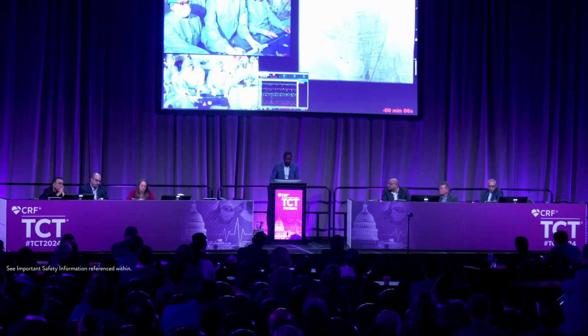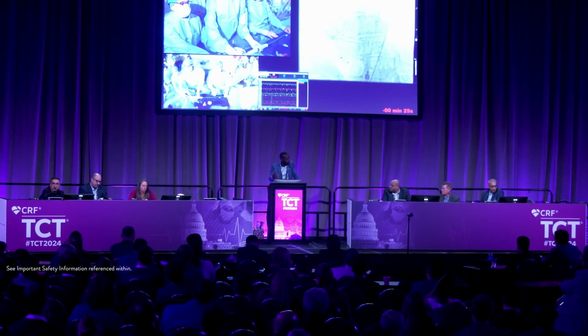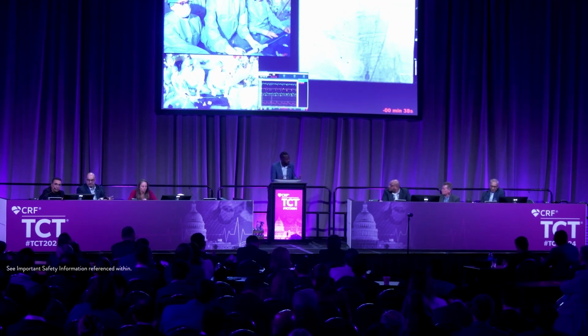Okay. So overall, this is a quite excellent outcome because a large annulus is always a challenge for us. You could use a 29 S3 Ultra, overexpanded, but if you have a device that reaches 35 millimeter, I think that's something that is going to be useful in daily practice. So we nicely saw how you did deploy the device, and particularly I'd like to emphasize the speed of deployment. It's very important. It's key to make sure that you take all the advantages of that platform with that stability.